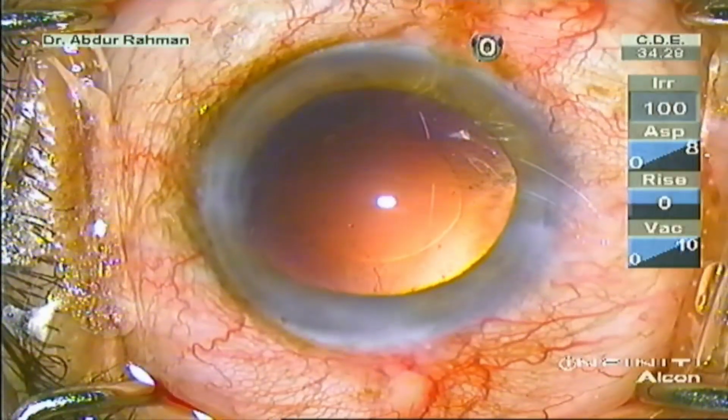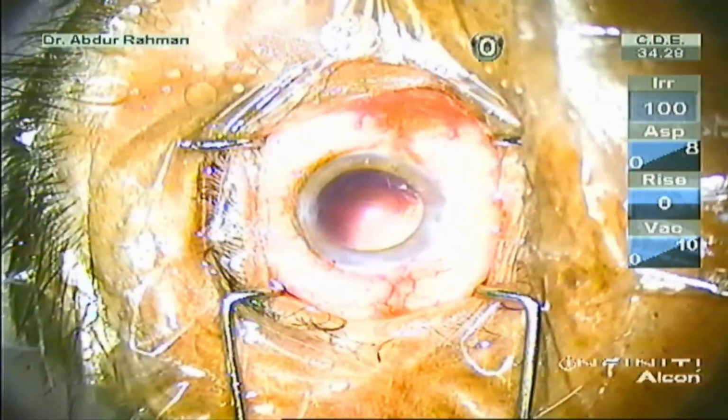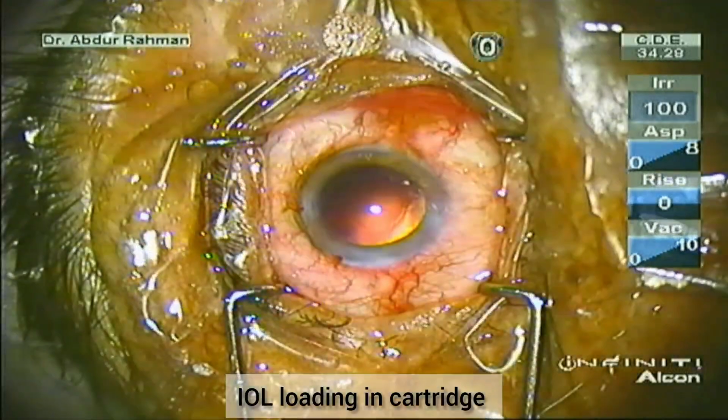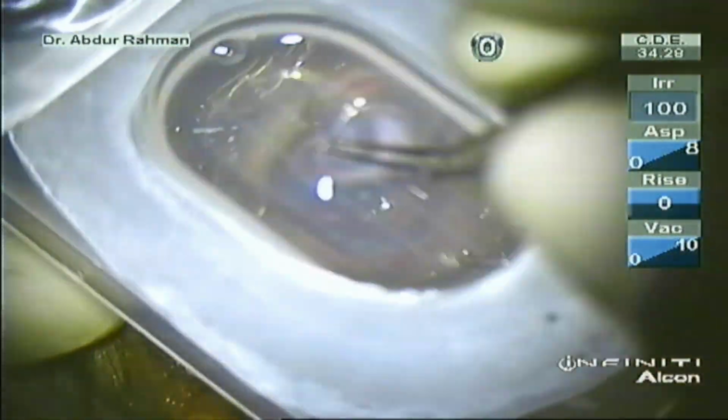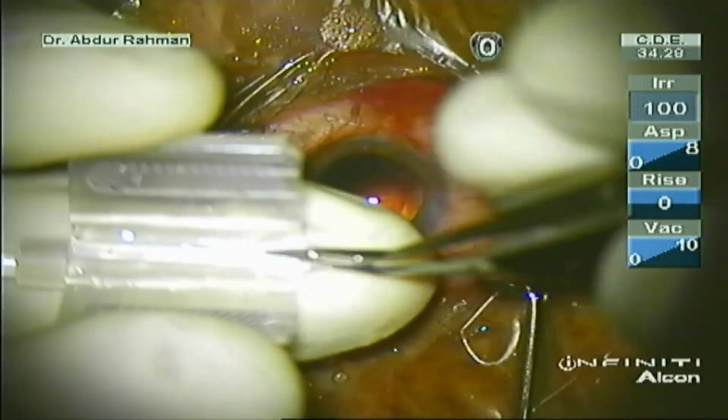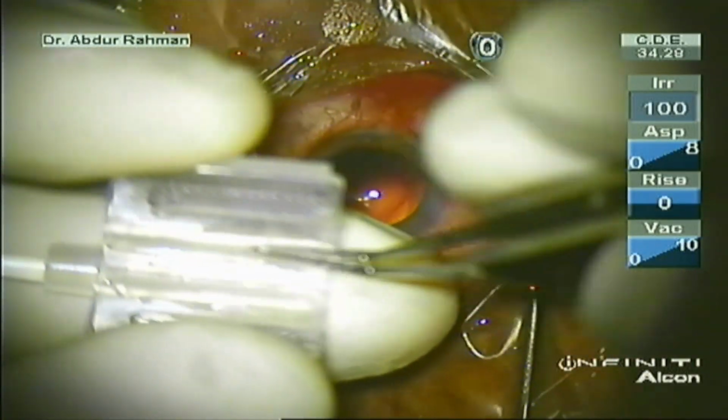Now commence with the IOL loading into the cartridge. Always remember to place the IOL properly into the cartridge so that it is in the alphabet S shape and all the haptics are securely placed.